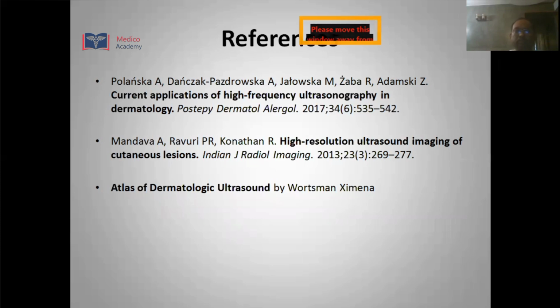So I would just like to conclude that ultrasound definitely has a very important role in identifying skin lesions, though they are more based on clinical diagnosis. But the extent of the lesion, the extension deeper, whether it is involving the epidermis only, the dermis, the hypodermis, or going deep into the muscular layer, can be assessed. Also, on treatment follow-up, when we have the base images, we can compare the post-treatment follow-up with the base image, seeing whether there is treatment response or not.